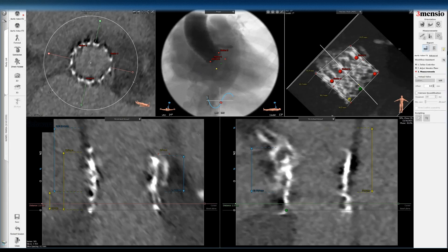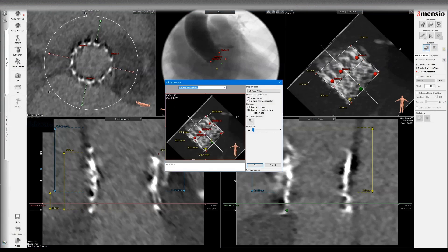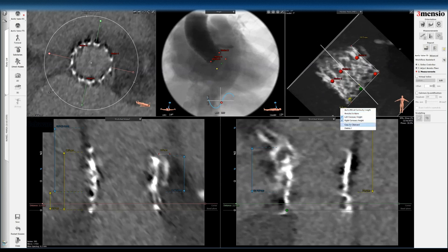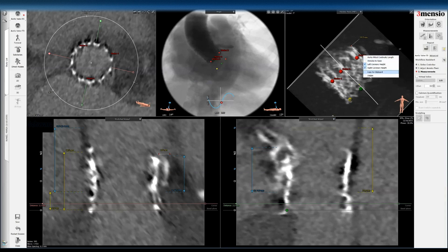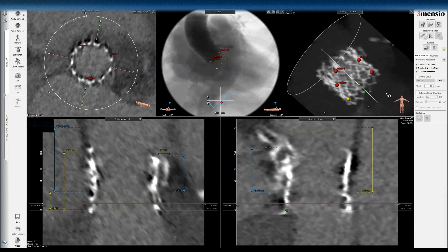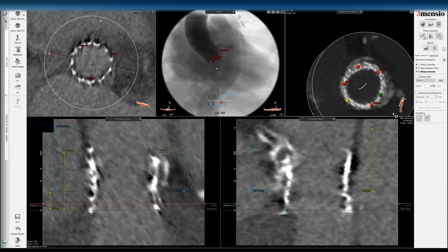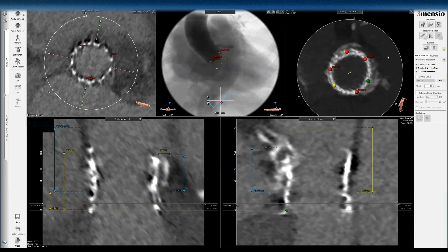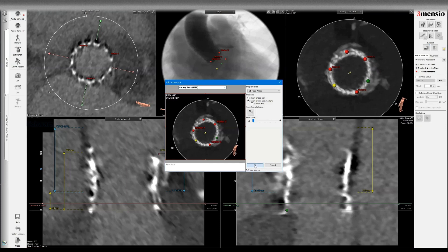That fluoroscopic assessment is more important than just the CT measurements here. I'll save these measurements, and you can also rotate this to the hockey puck view, where you can see that the valve is not exactly circular.